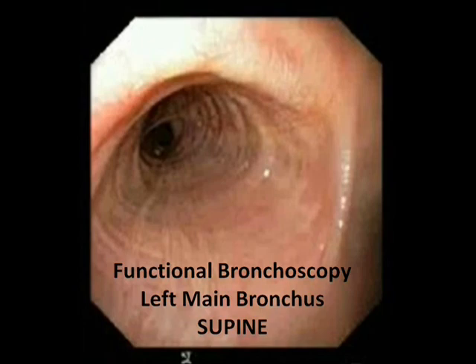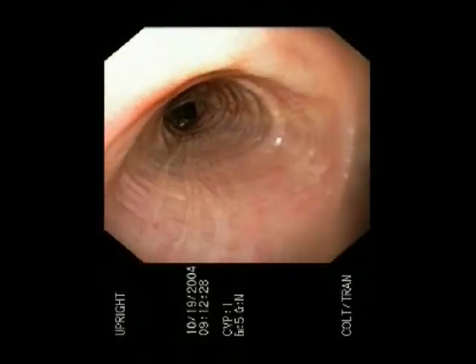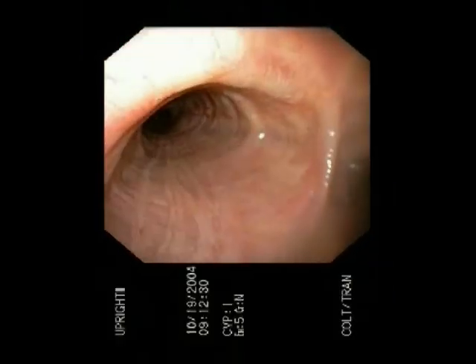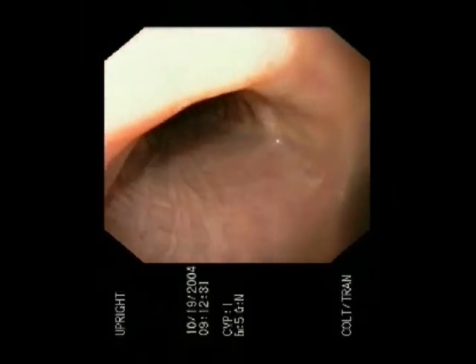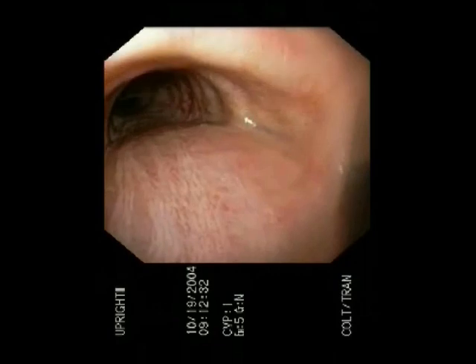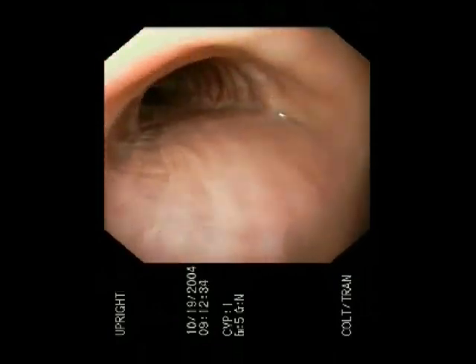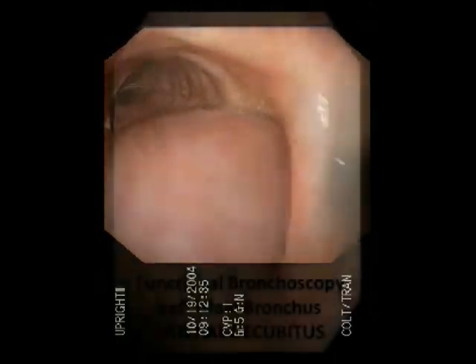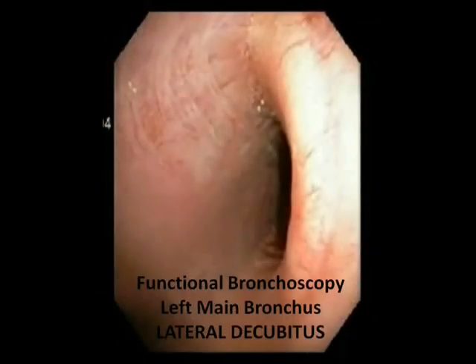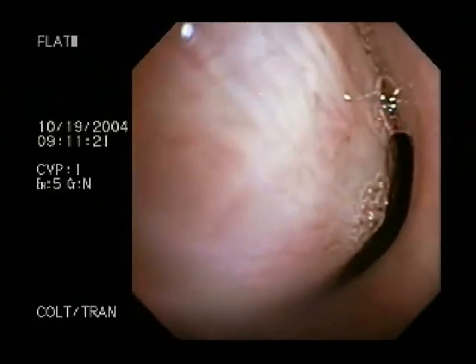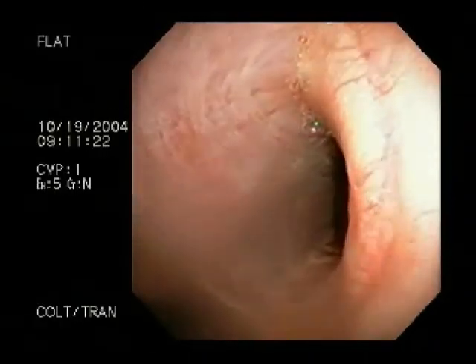Here, in both the upright and supine positions, the left main bronchial diameter is normal, whereas in the lateral decubitus position, excessive dynamic airway collapse is evident.